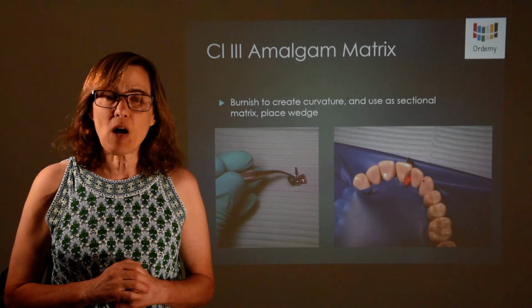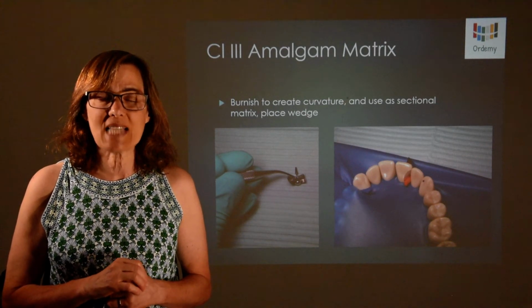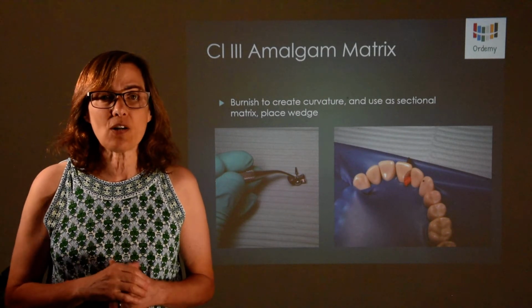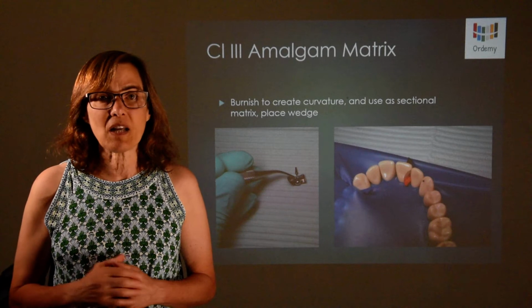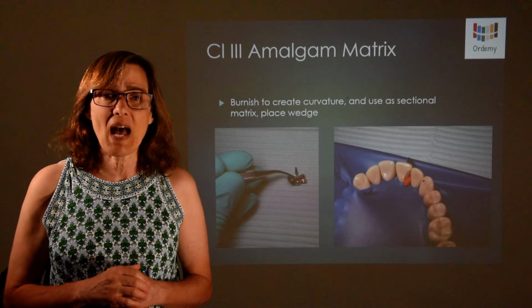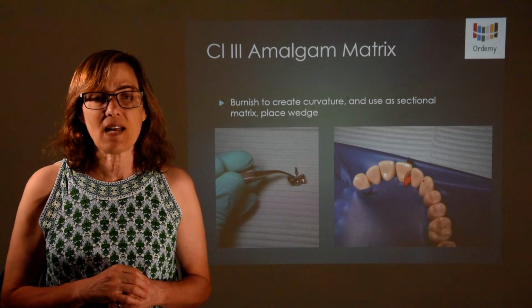Amalgam can be polished, but it needs 24 hours to have a proper set, so the patient can return at a recall appointment. The amalgam can be polished, or you could have the patient come back within a 24-hour period and polish the amalgam.